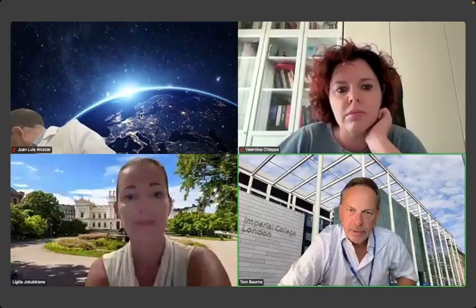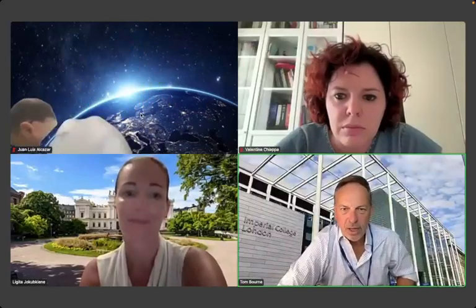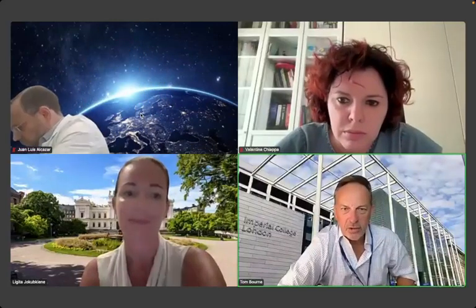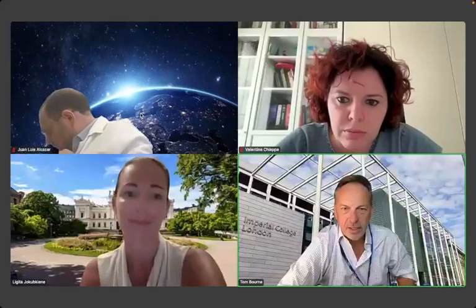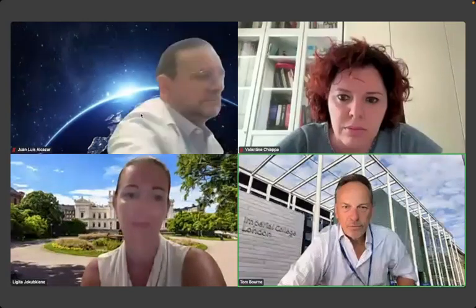Because I think if you're not very experienced and you want to rely on the AI tool to generate the appropriate planes, it seems to me that you still have to have the knowledge base and experience to recognize that it's not correct, and therefore correct it. So at what point do you think it's going to be good enough that you can effectively not have that knowledge and rely on it? Does that make sense?